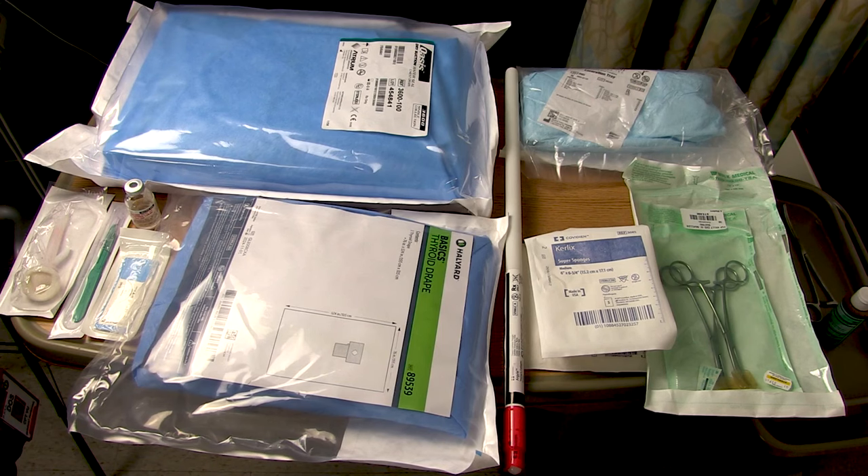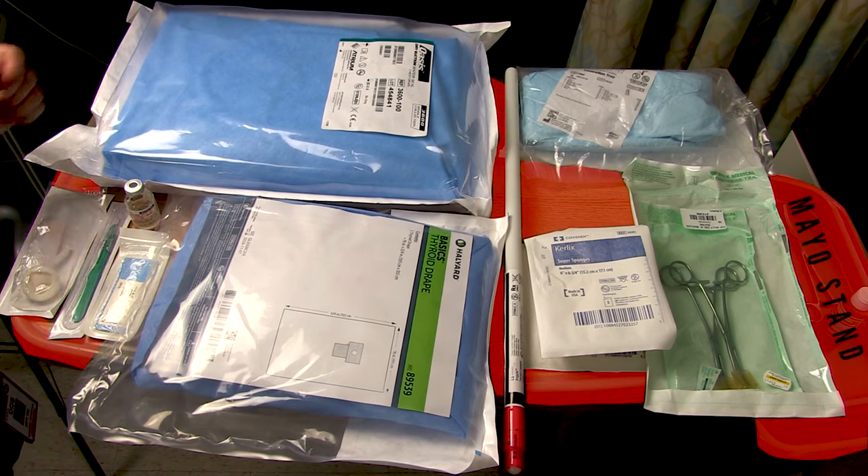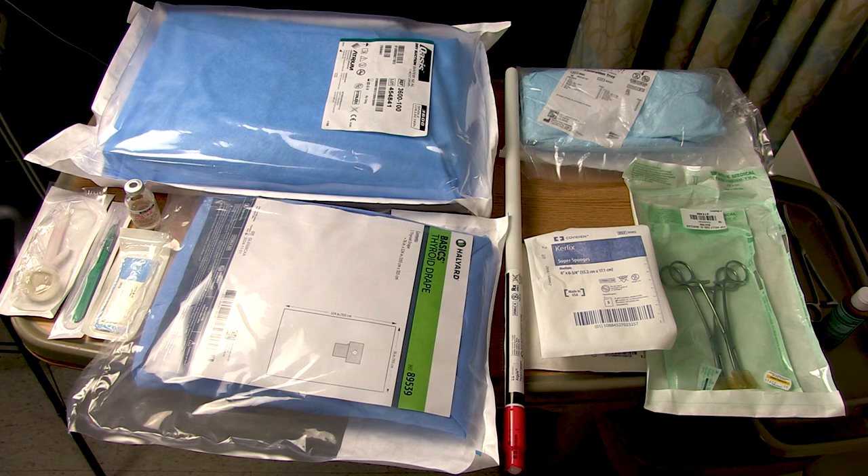In the room, you should have a mayo stand or similar surface to stage all of your equipment on. At minimum, you need a 15 blade knife and a chest tube. In an emergency situation, that's actually all you need to just get the thing in — that and your finger. If you have the time, you should also get a water seal suction chamber like this atrium device, two pairs of long, skinny, curved clamps — classically Kelly's — and a generous pack of gauze.